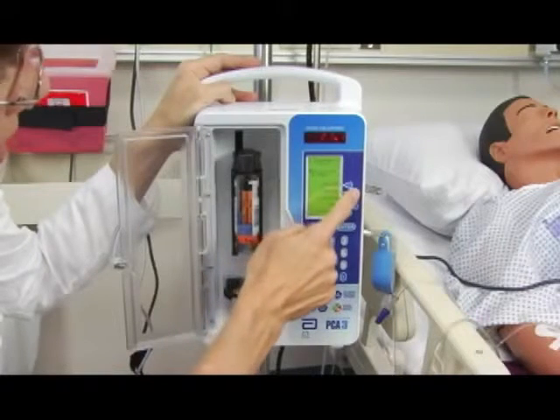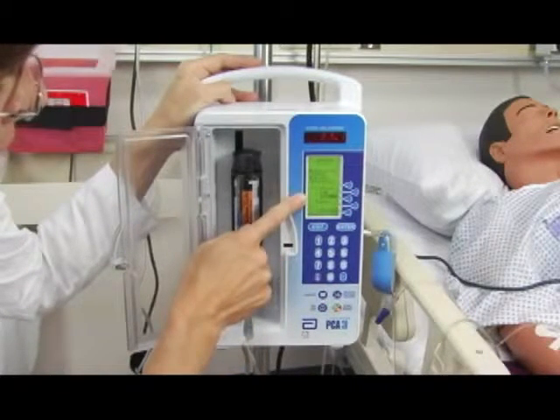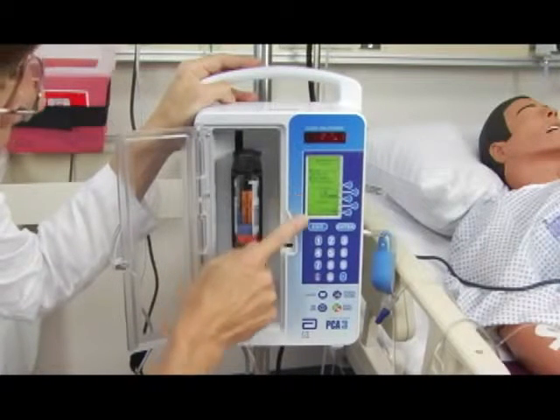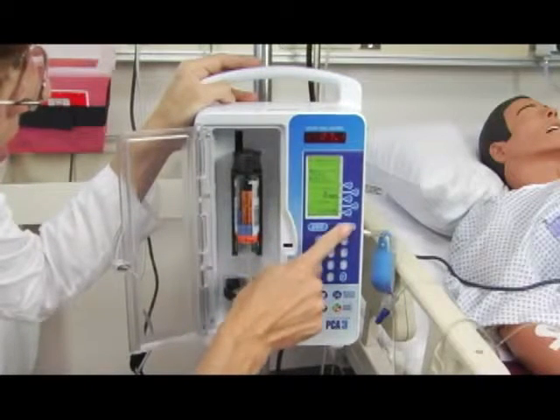Next, let's change our lockout interval. Currently, our lockout interval is 10 minutes. Let's say the physician said to change it to 8 minutes. We'll press the 8, change it to 8, and press enter.